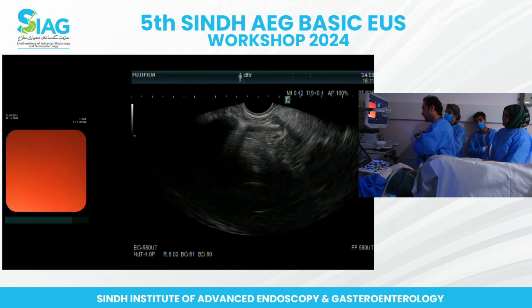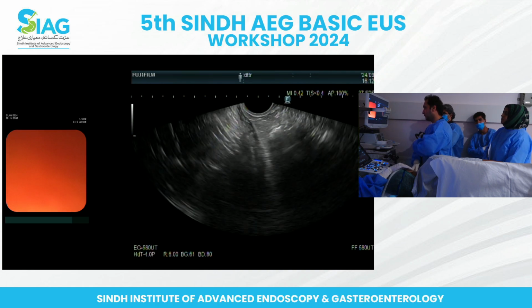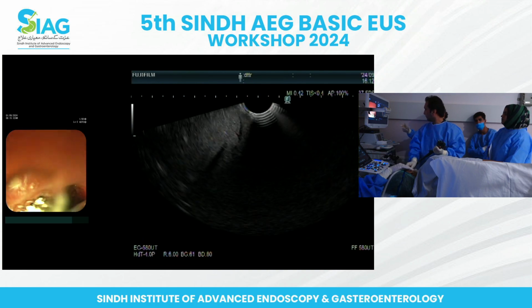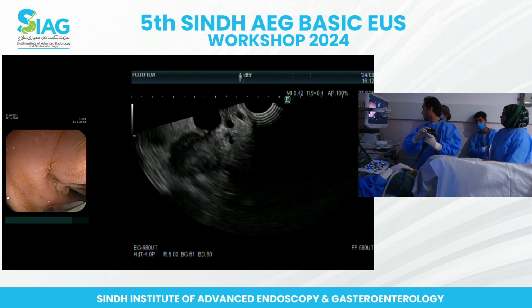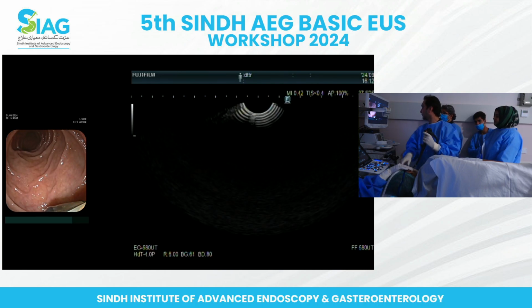Yep, okay. So now you've gone past. You just started to see the uncinate of the pancreas. So let's get into the D2 mode and start coming back from there. Once you've gone there, I'd still get used to the small right wheel. It's always useful. That's good. And that's the mass we just saw already. But that's okay. Lovely. Very nice.